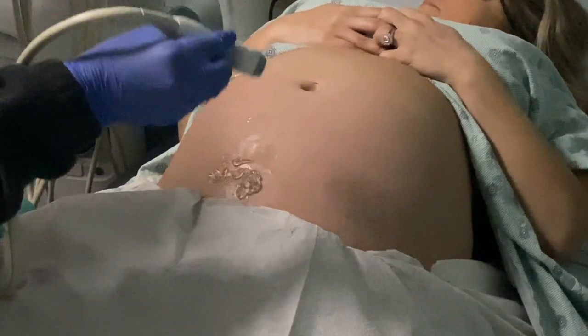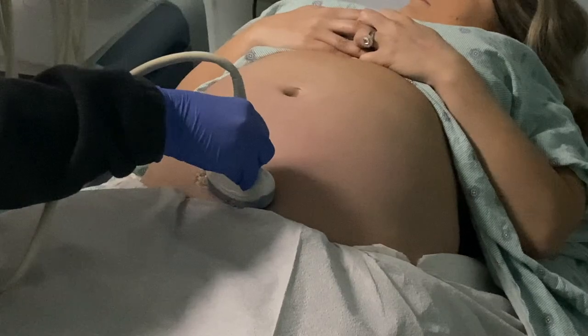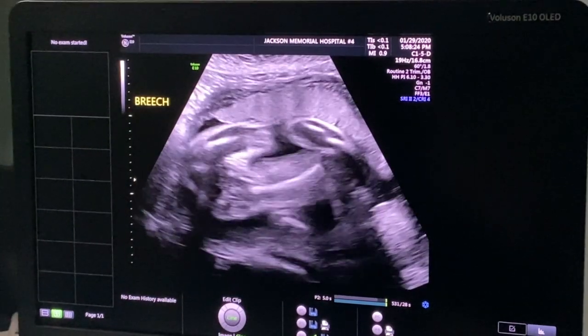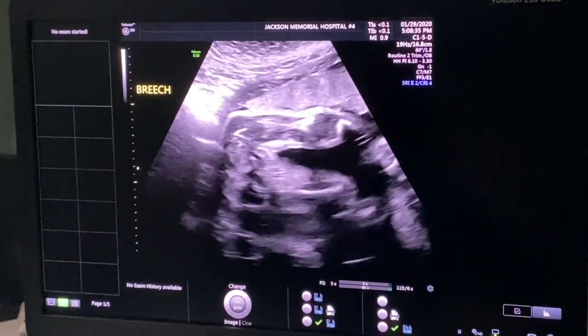Now we are ready to go over the steps of a basic level 1 ultrasound. This tutorial assumes a singleton pregnancy. Place the transducer transversely just above the pubic symphysis and angle towards the cervix. A fetal head confirms a cephalic presentation. Presence of fetal buttocks and bladder confirms breech. A transverse lie requires further interrogation.